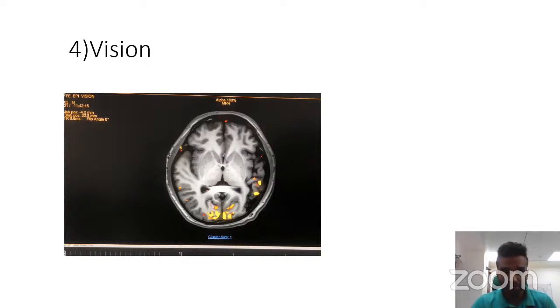In this patient the lesion is slightly inferior, but the generation of the signal is superior to the lesion. So again, another good sign. So this is all about some of the different cases I've shown of hand movement, foot movement, thinking, vision, etc.